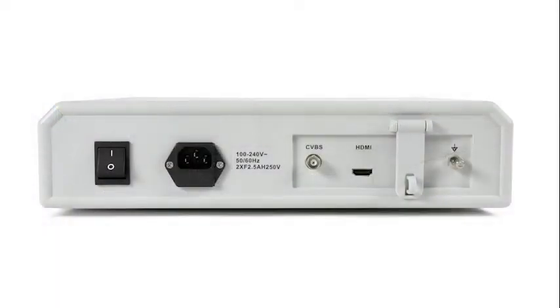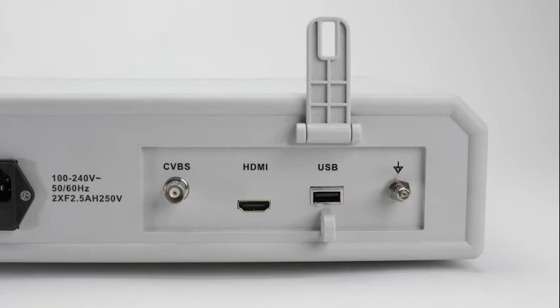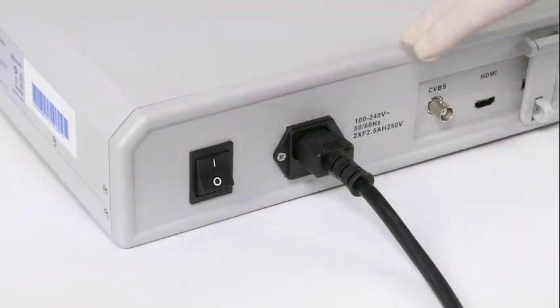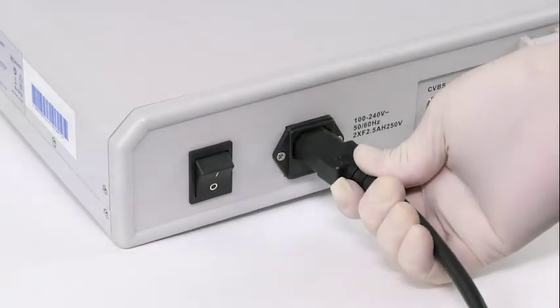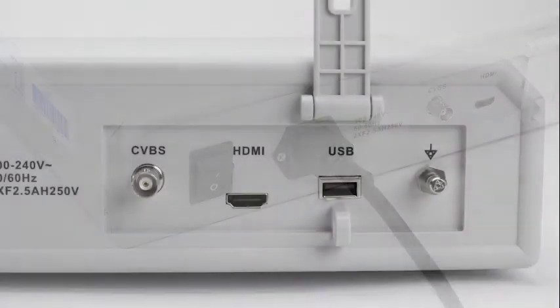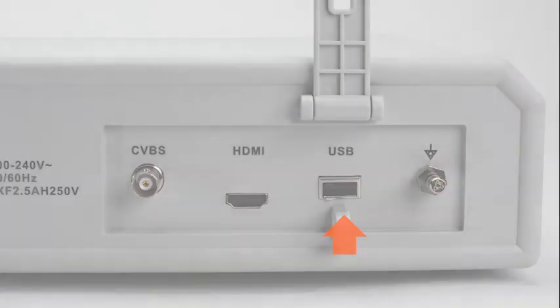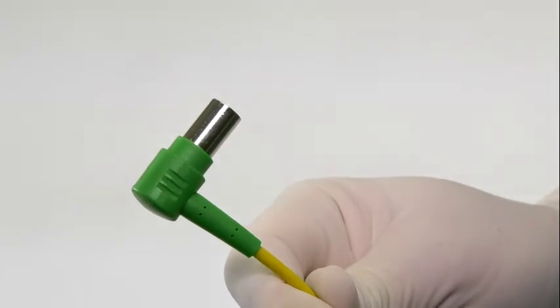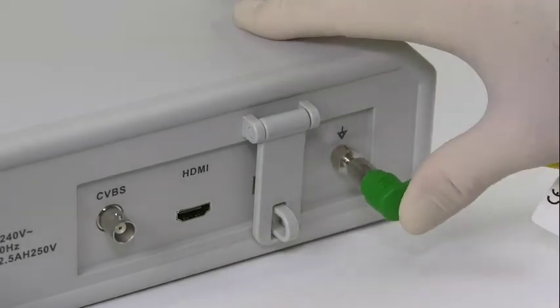The rear panel of the image system consists of six components: main supply switch, power input socket, USB output, HDMI output, CVBS output, and the equipotential bonding terminal. The main supply switch allows the BD-APTRA image system to be powered on and off. The power input socket is where the power cord connects the image system to the hospital's electrical outlet. The HDMI output and CVBS output are options for connecting to a monitor screen or computer. The USB Type-A output supports a USB flash drive on which video and still images may be downloaded. To prevent electrical shock hazard, the image system should be connected to a potential equalization busbar via the built-in equipotential bonding terminal using an equipotential bonding cable.